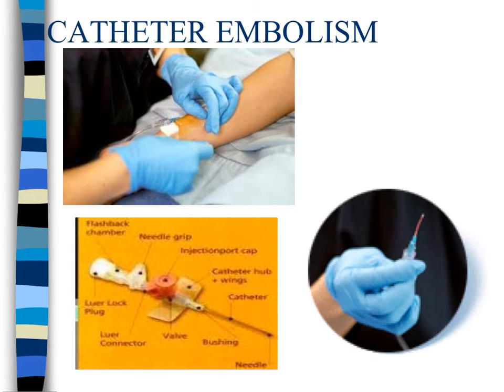A catheter embolism can occur during the insertion of a catheter if appropriate placement techniques are not adhered to. The tip of the needle is used during the placement of the catheter and can shear off the tip of the catheter. The catheter tip then becomes a free-floating embolus. This can occur with both over-the-needle and through-the-needle catheters. If this happens, cardiac catheterization may be required to remove the embolus, or the piece of that catheter.